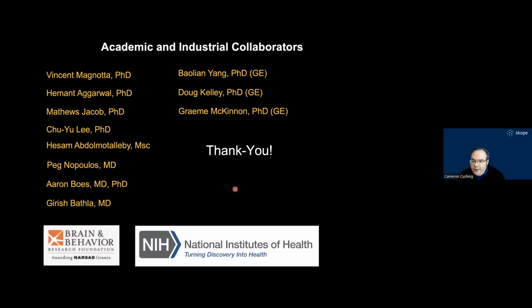Question from Hong Li. Thanks for the great talk. It seems the goal is to compress the dictionary using deep learning. Is this the correct understanding? The goal is to come up with a compact subspace which can be used to constrain our reconstruction. If you have a lot of Q-space samples, then the autoencoder is good at compressing that and coming up with a nice compact representation of the manifold to which those samples belong, which we use as a constraint in the undersampled reconstruction.